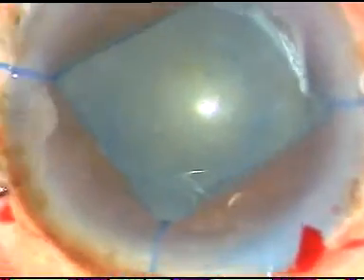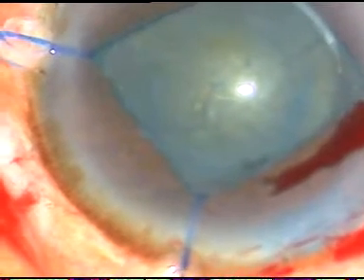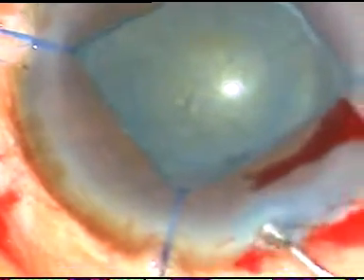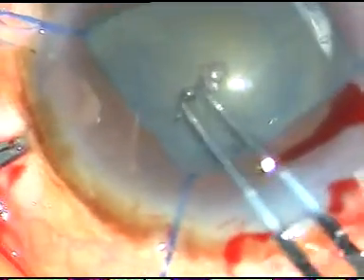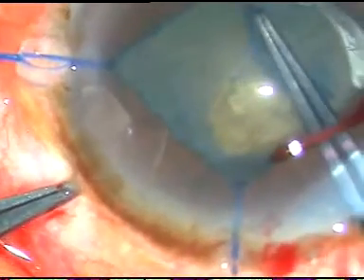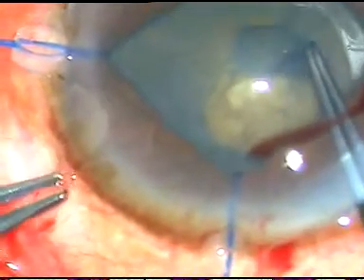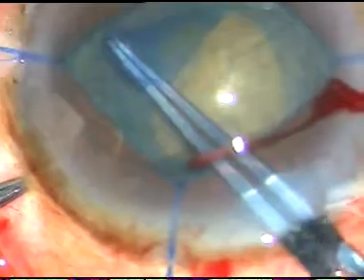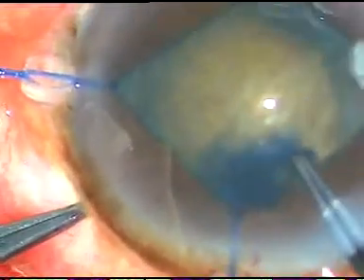Now I incise the anterior capsule with a 26-gauge bent needle. I raise a flap and come out. Now I use utrata forceps, inject some more visco, hold this capsular tag, and move anti-clockwise to do a CCC — continuous curvilinear capsulorhexis. See how easy and safe this surgery becomes if we just dilate the pupil with iris hooks.